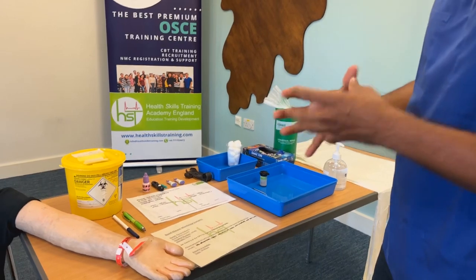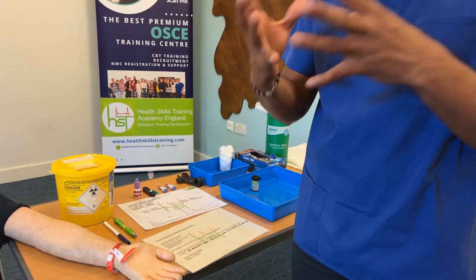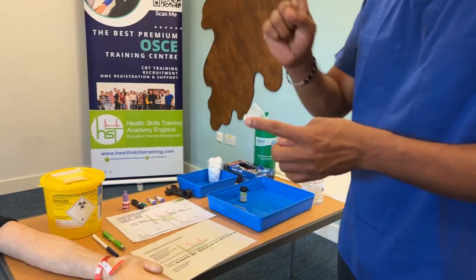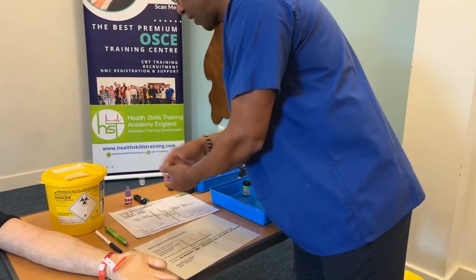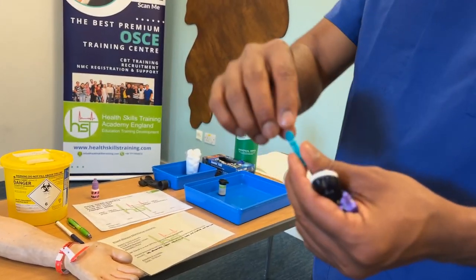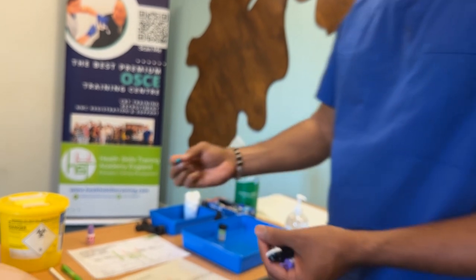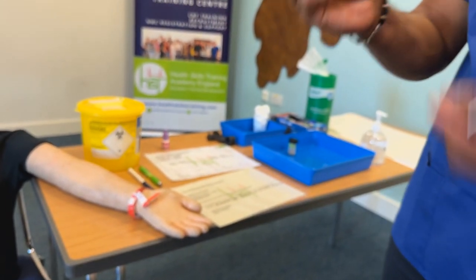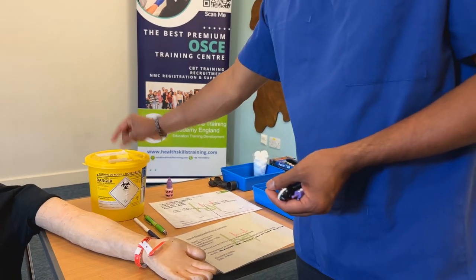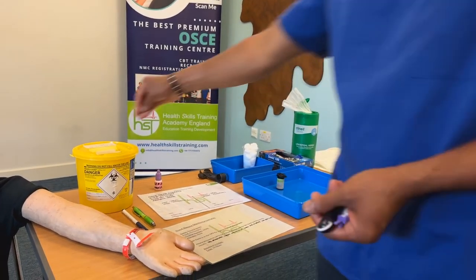Next is the lancet. People struggle to understand — there are different types of lancet you might come across, but the function is pretty much the same: you need to expose the needle. With this first type, you twist a particular bit to expose the needle. When you expose the needle, go to the finger and prick it. Once you prick it, it needs to go straight to the sharps bin — you cannot put it back in the tray. That is a common error because it is a sharp.